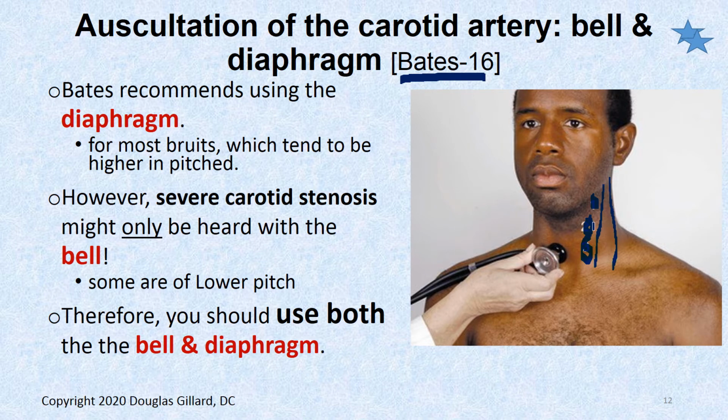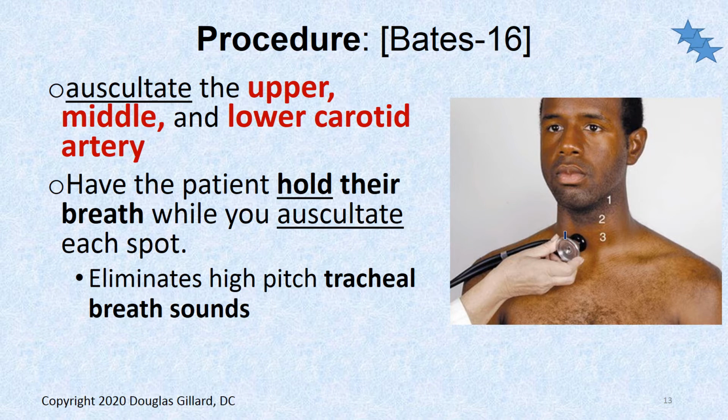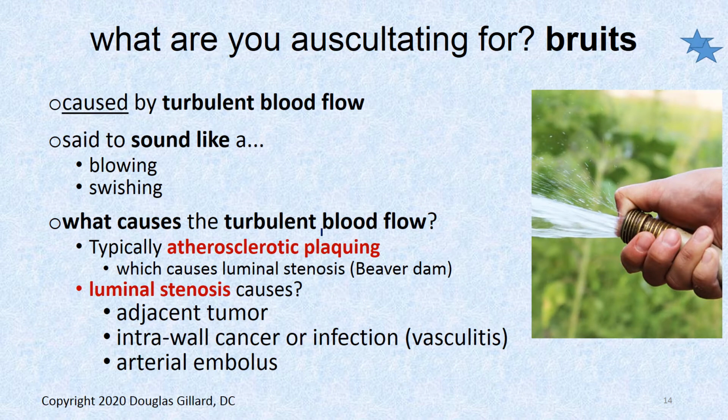The patient should be holding their breath while you're auscultating too, because the tracheal sounds will be really loud and you won't be able to hear things. Holding the breath eliminates those tracheal sounds. Why are you auscultating? You're listening for bruits or turbulent blood flow.